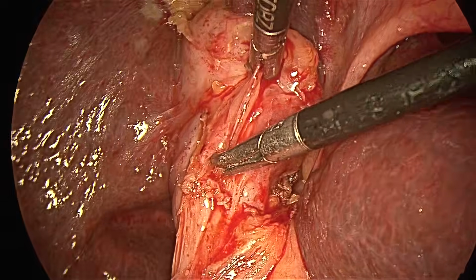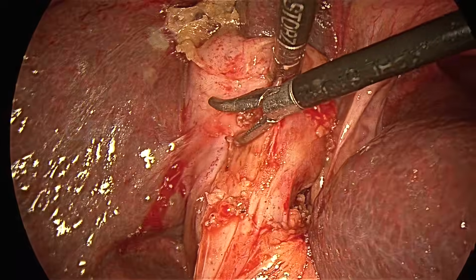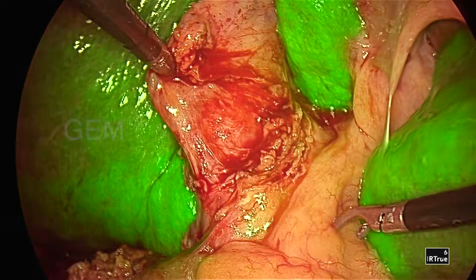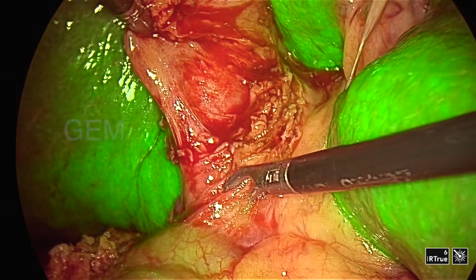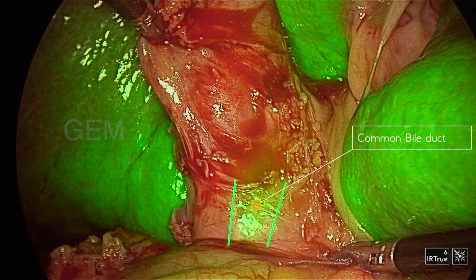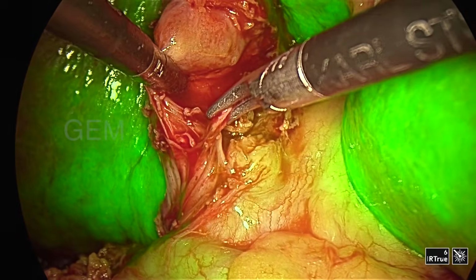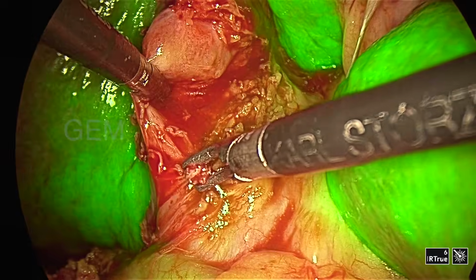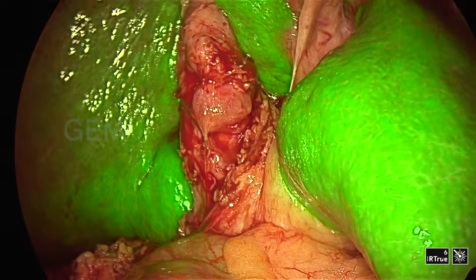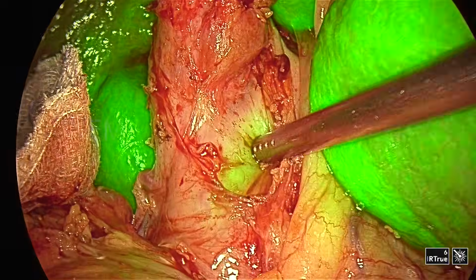Usually, I used to tell in my previous videos, always remember that the infundibulum is lying on the right duct. So once you open the posterior peritoneum and lift the infundibulum, create the space. Now I switched to IR mode, and you can see the infundibulum, the CBD, the common bile duct is seen well, and that is the cystic duct. According to the MRCP imaging, the cystic duct is going parallel to the CBD, a long, thick cystic duct, and it opens into the CBD very low down, a low insertion of the cystic duct.